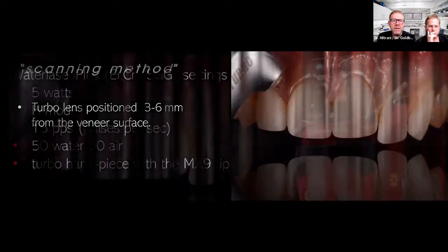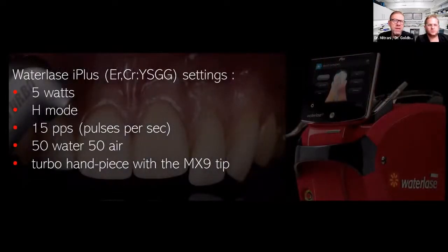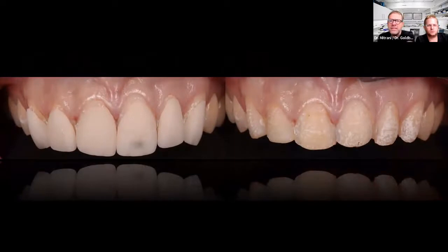And so again, these are some of the parameters, Jack, that we utilize, and you'll notice here, these are parameters for the turbo handpiece. And as you will see, we can also utilize the gold handpiece to remove the veneers. It's not specifically for the turbo, but these are pretty much our preferred settings when utilizing them to retrieve the veneers. And as you can see in these images, we're able to remove the veneers. They come out very, very smoothly. And then it's just a matter of cleaning up the prep.